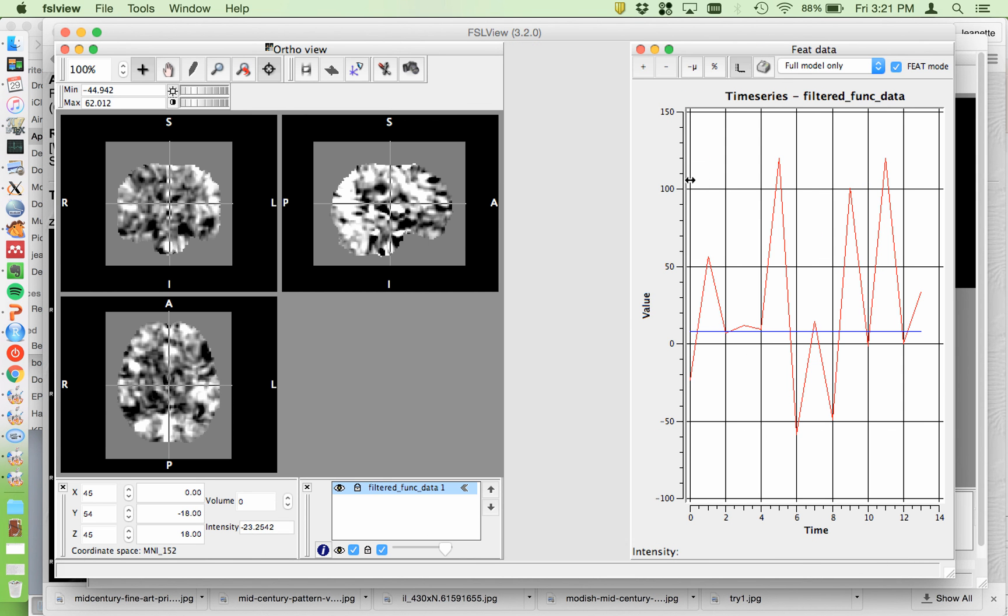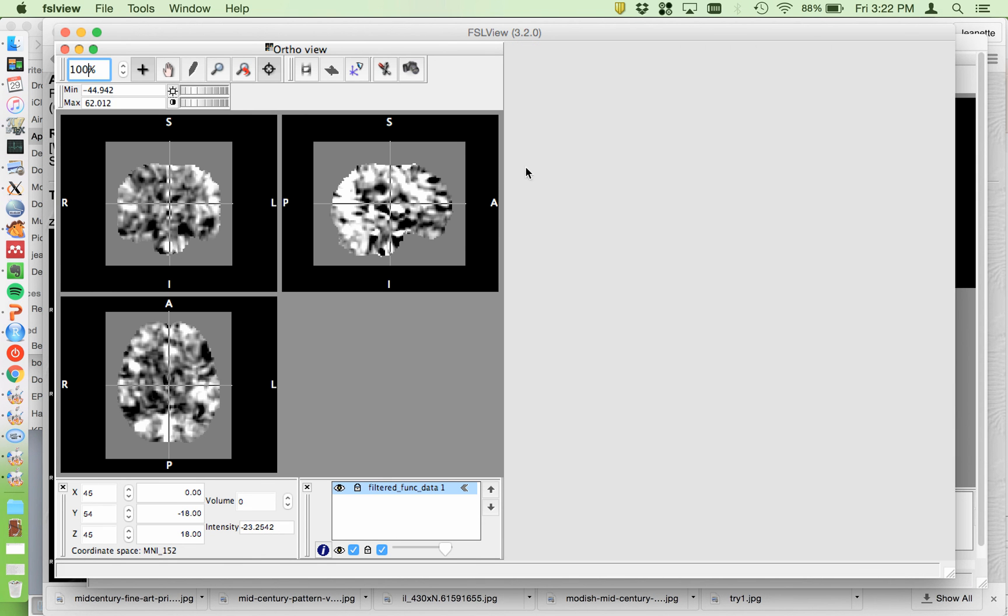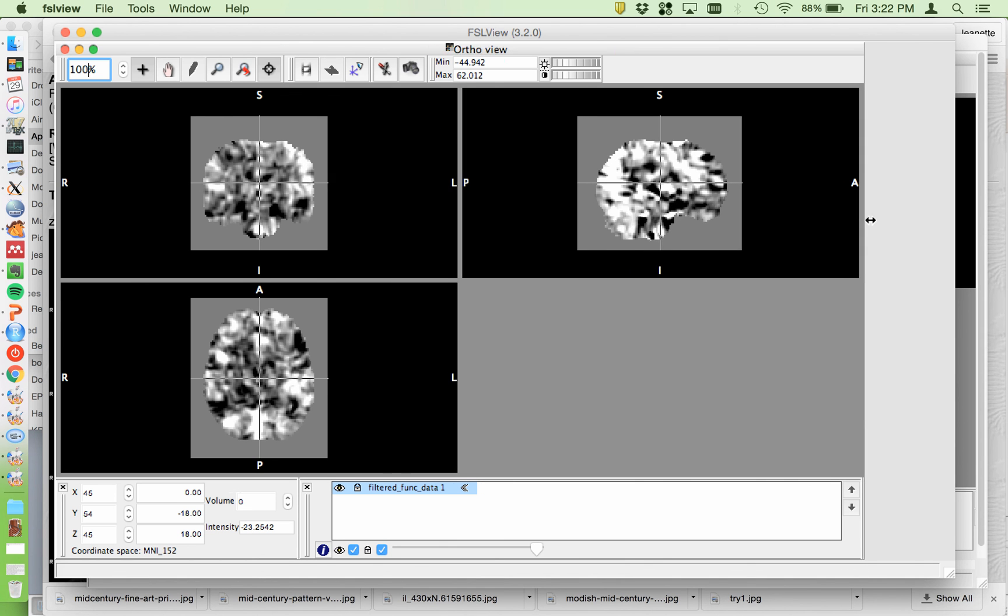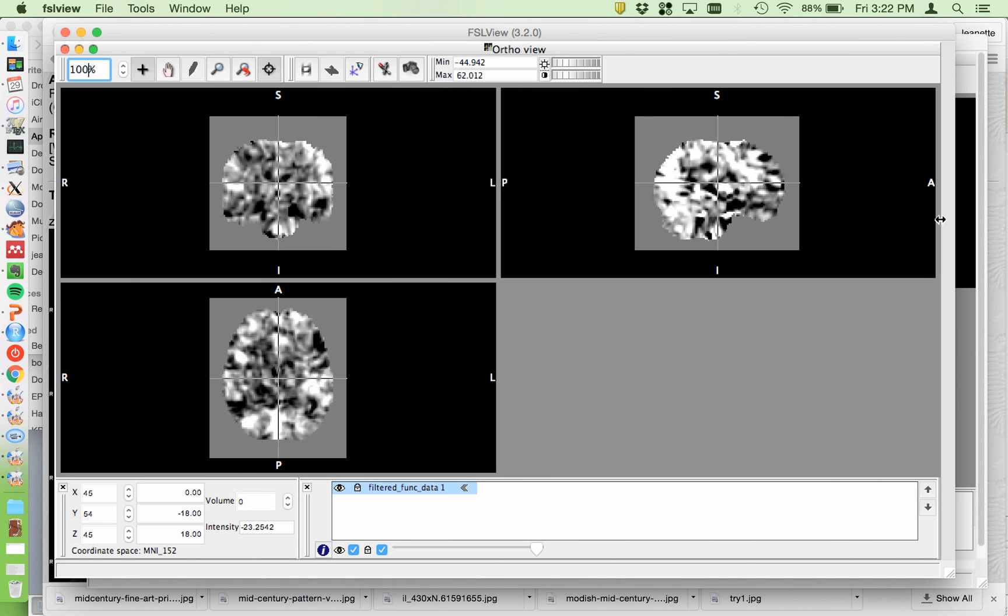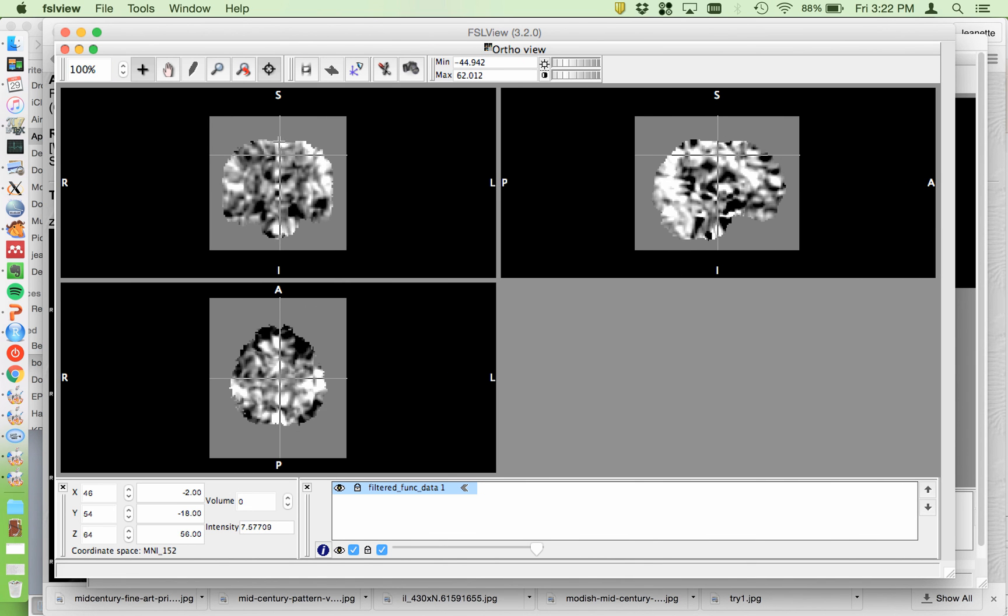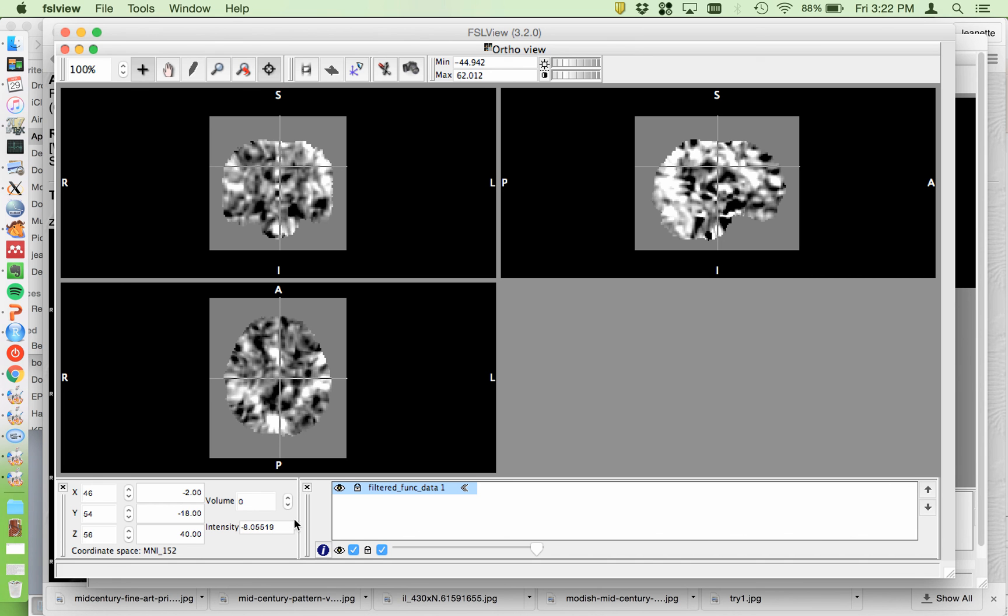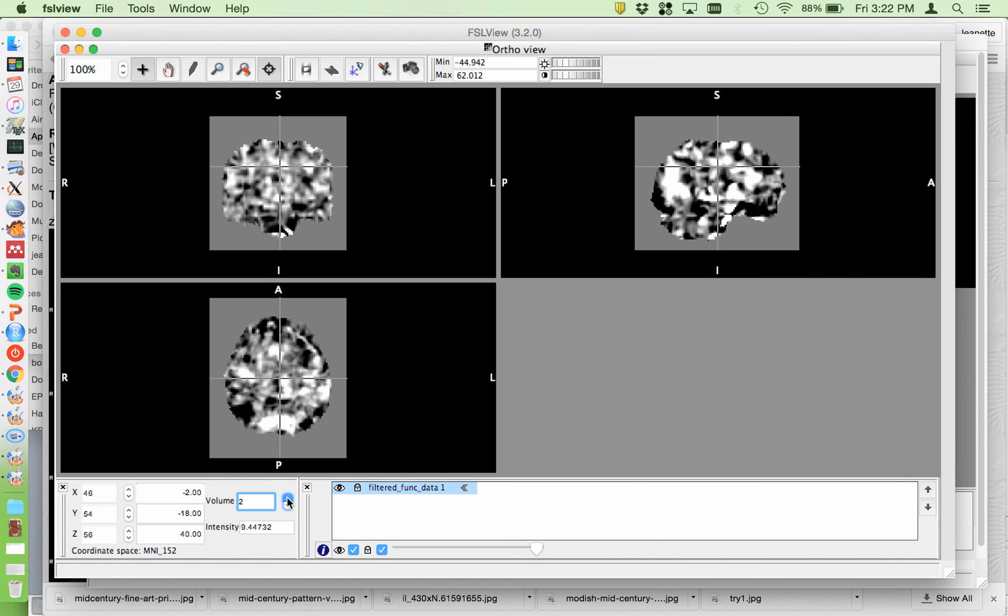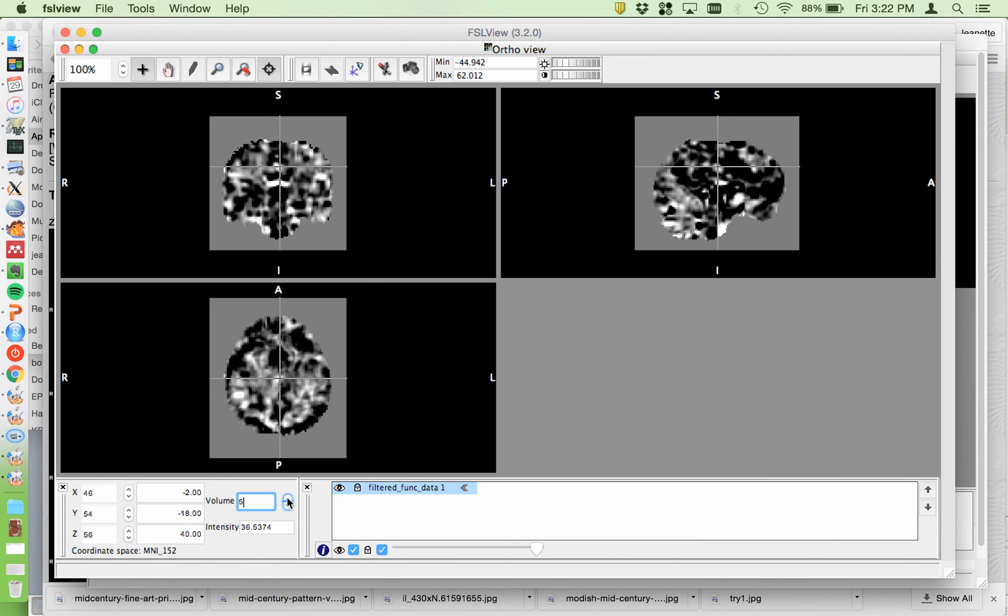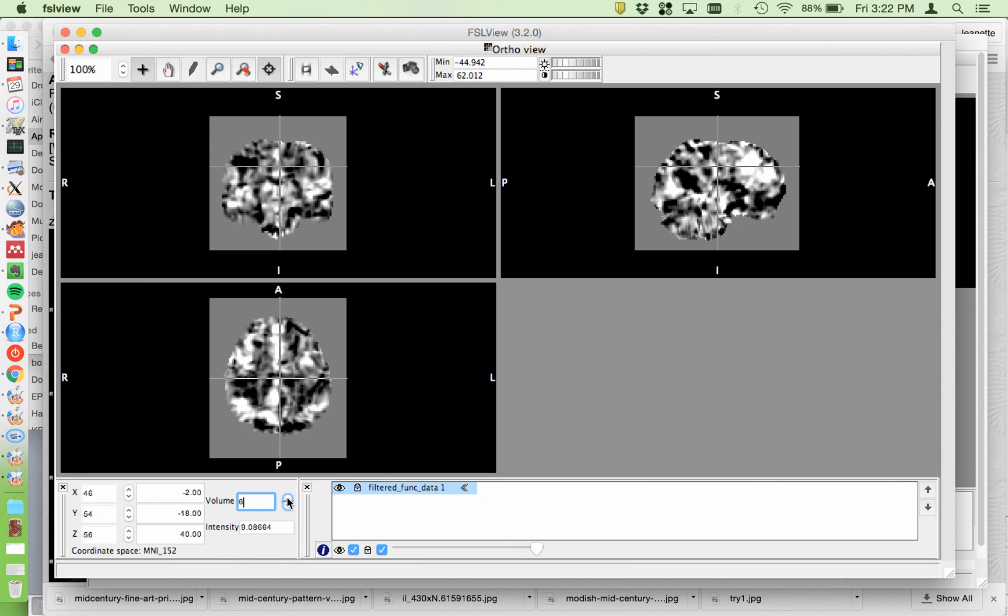There used to be a funny error where when MTEVs were used, FSL put the structural in place of the data for an MTEV. So that would cause quite an error in your analysis. So anyway, just want to flip through these and make sure everybody looks okay.